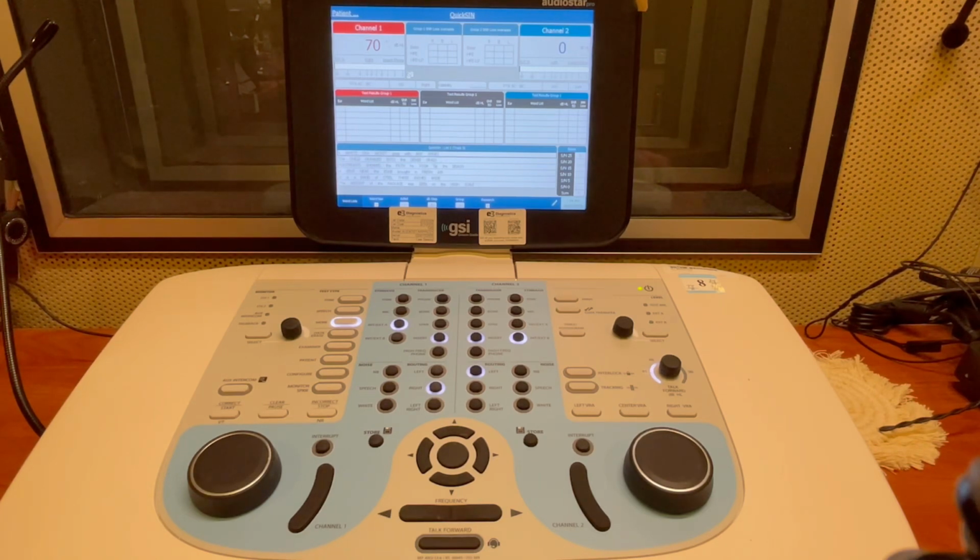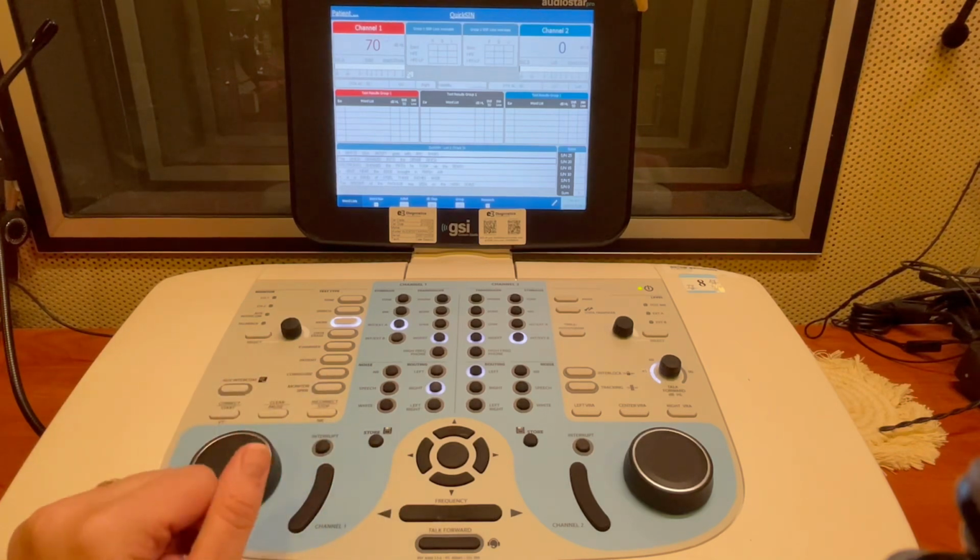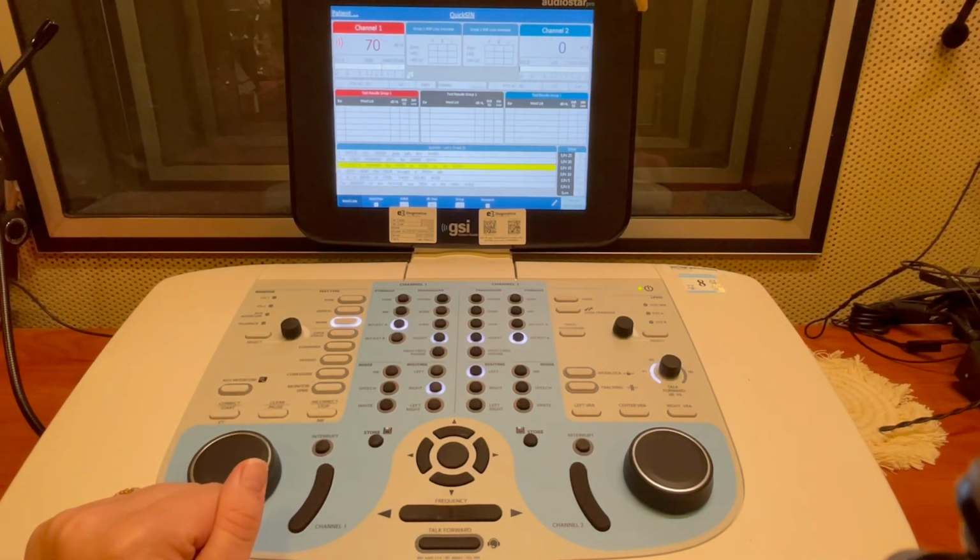If they got that correct, we're just going to click on the next sentence. And so the child crawled into the dense grass. And we'll say that they got 2 of those words wrong. So we just hit the incorrect button there. And then we would go to the next sentence. And we'll say they got that one correct.